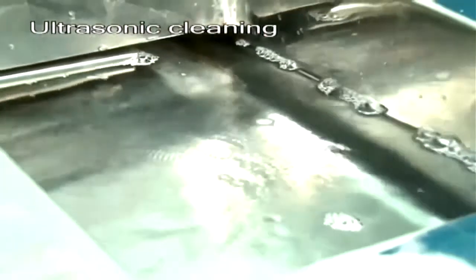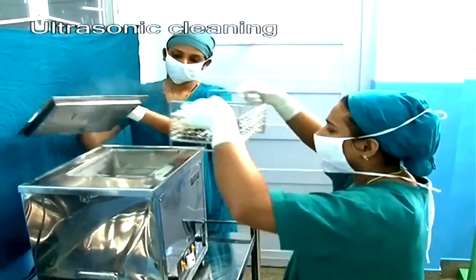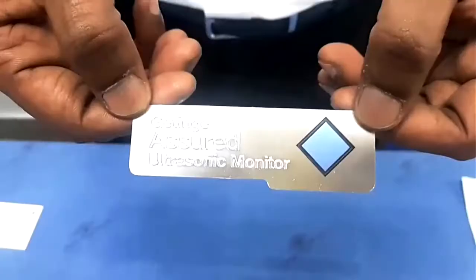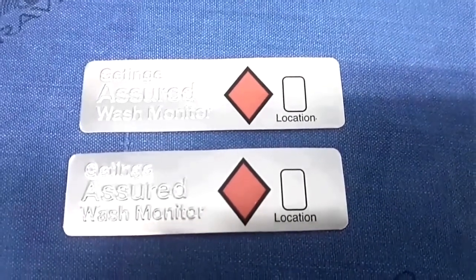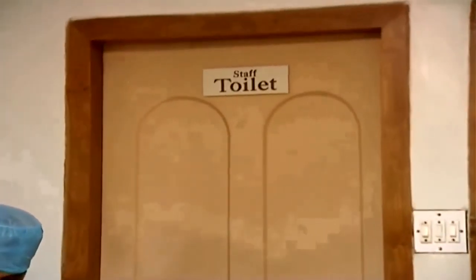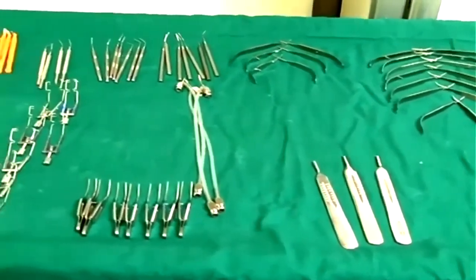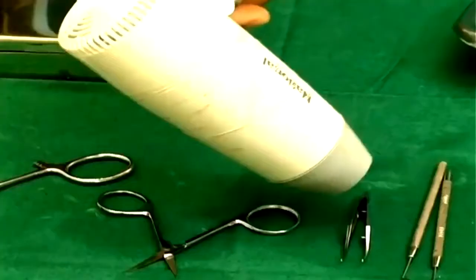Then ultrasonic cleaner is very helpful in ophthalmic practice, and the enzyme is controversial. It's better that we don't use the enzyme cleaner. Ultrasonic cleaning is enough, and we have indicators for the ultrasound cleaner where the red color turns blue. And the place where you're cleaning is also quite important. You should have a specific place, not outside a toilet like this. And the instruments should be thoroughly dried before you pack for autoclaving as well as ETO.